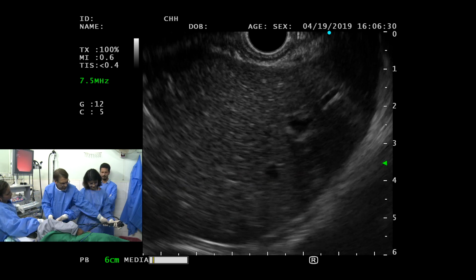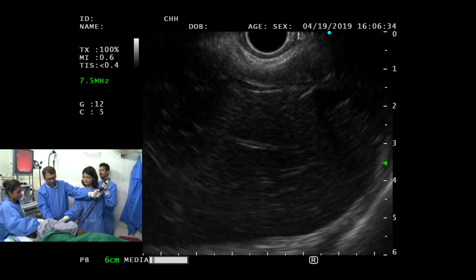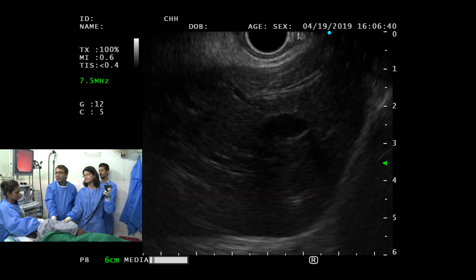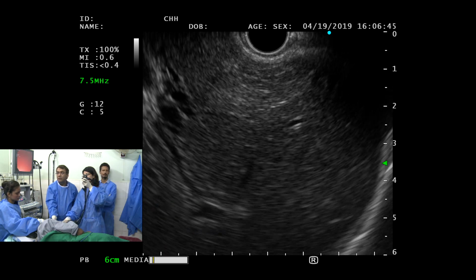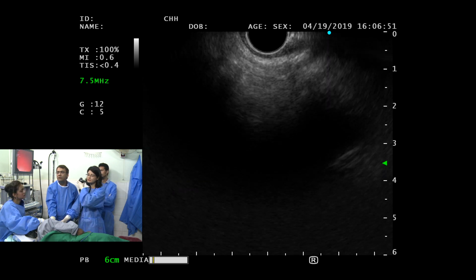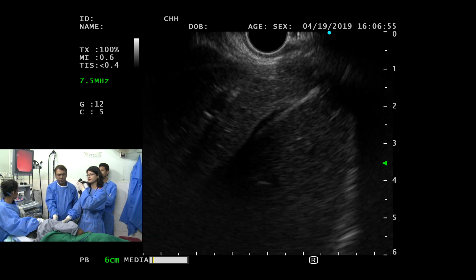So now if you bring the scope, you see how the numbers are moving like that? They need to move like that. Okay. So we're going to bring from 180 to 90. Keep coming back. Keep coming. I don't see the movement of the scope. Okay. Now it's moving. Yeah. Okay. Keep going. Keep going. That was IVC? That was IVC. Okay? Keep going. Big wheel towards you a little bit. Keep going to the right.